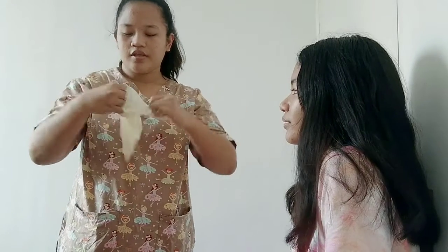Now I'm going to remove my gloves and dispose of them in a proper area. And dispose of all the used needles in a waste receptacle. Then we are going to perform hand hygiene and then document the procedure and interpret the result.